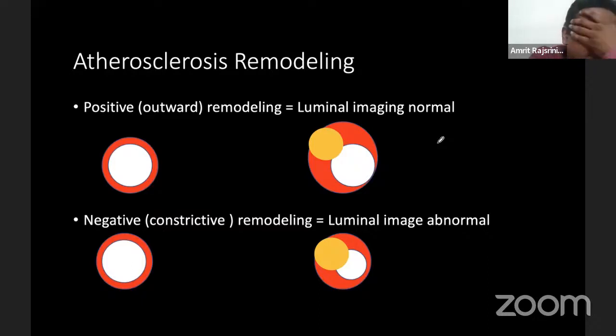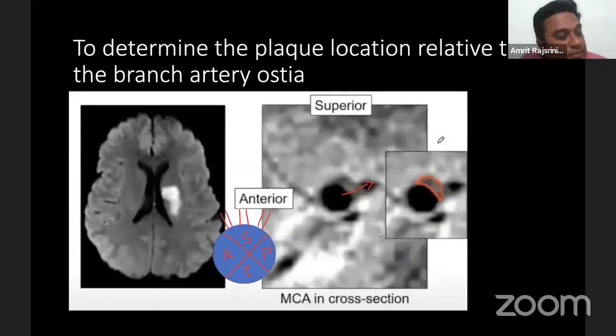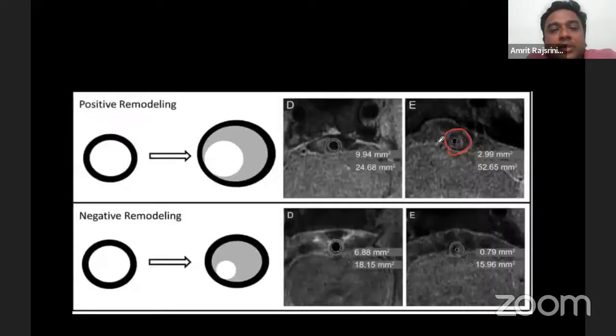You showed me one case where there's a bifurcation T1 hyperintensity. So normally, whatever is at the bifurcation is usually a clot, right? ICAD, vasculitis, very uncommon. Whenever the bifurcation is involved, we tend to say it is not intracranial atherosclerotic disease, at least in the MCA. Similarly, when there is a narrowing involving the terminal ICA and the A1 and M1, generally it's not atherosclerotic.